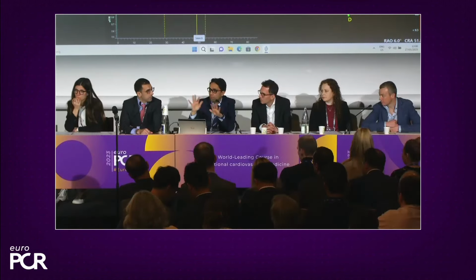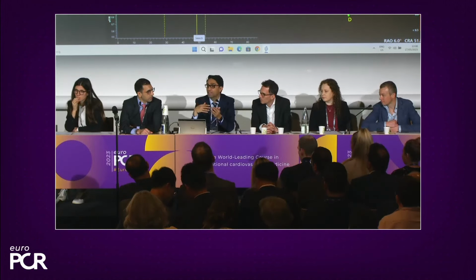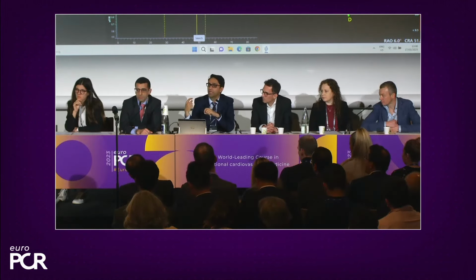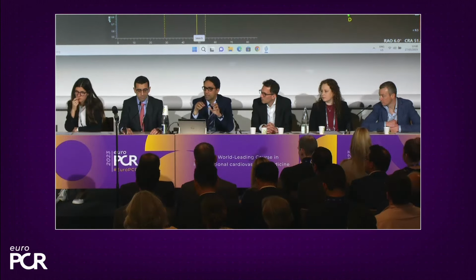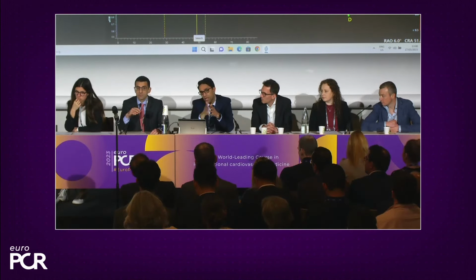You are correct, there are multiple systems. One requires a special connection of the blood pressure to improve the fidelity. Some of them don't require blood pressure, but they're all validated in slightly different ways. This specific system uses manual entry of the blood pressure at the time of your recording.